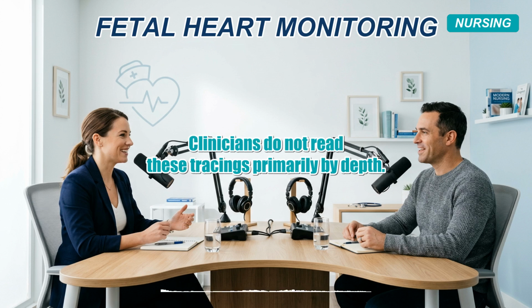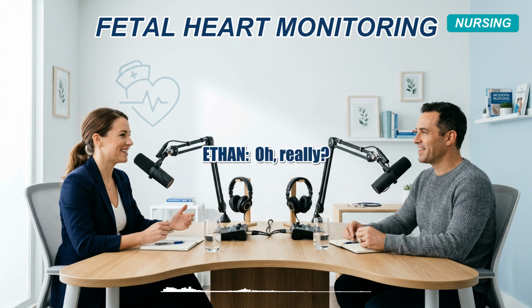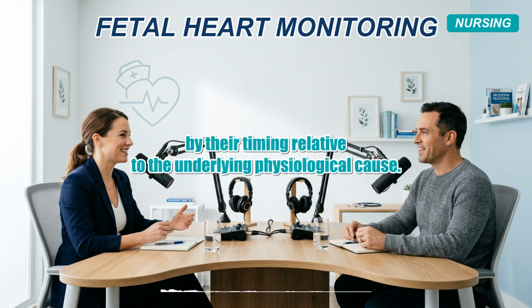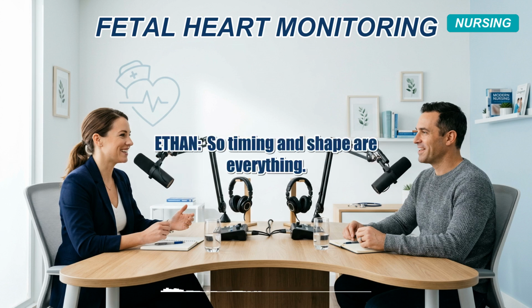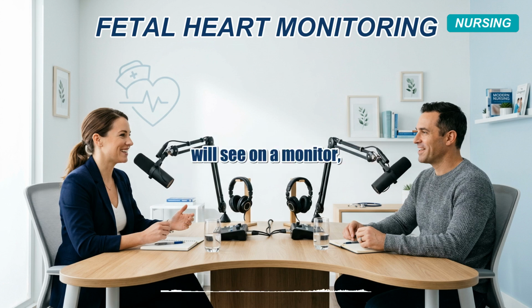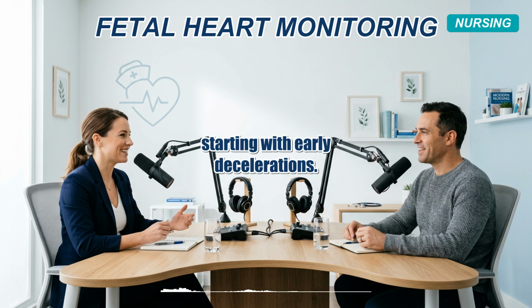Clinicians do not read these tracings primarily by depth. Oh, really? Yeah, they categorize decelerations by their shape, by their timing relative to the mother's contraction, and by the underlying physiological cause. So timing and shape are everything. Yeah. Let's break down the three main types of decelerations you will see on a monitor, starting with early decelerations.